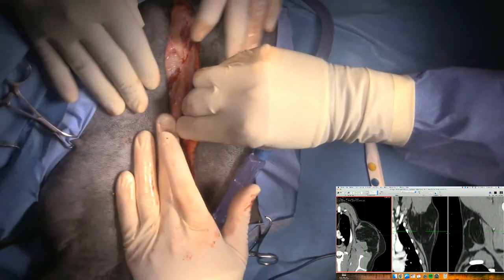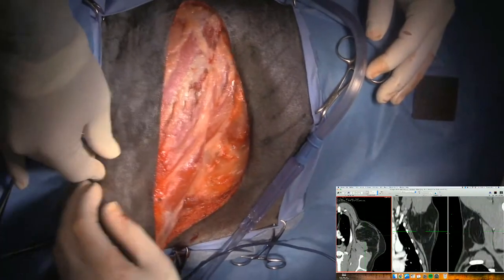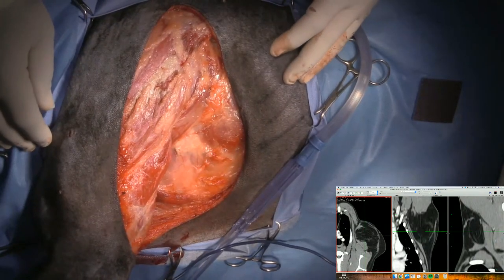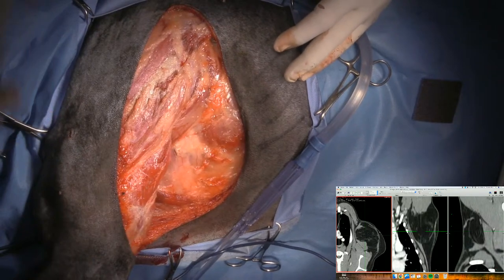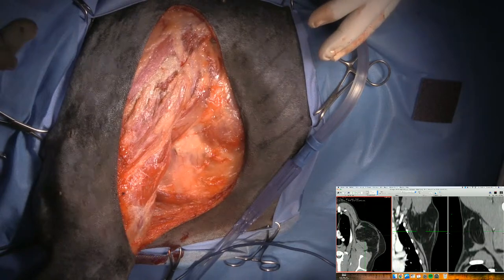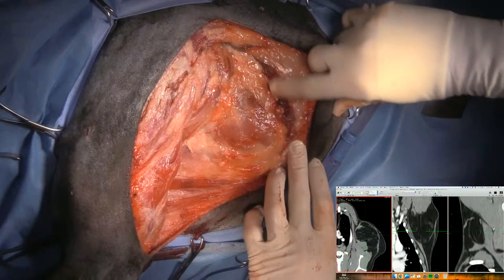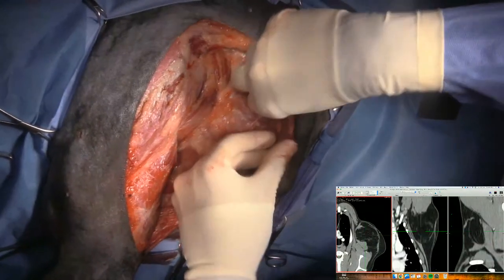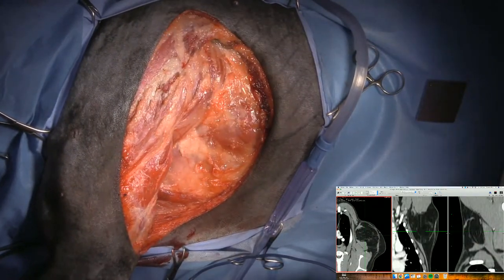Is this going to close? I think it'll be fine. I'll pull the leg back a little bit with my deep closure. So that's the cut surface, cut edge of the latissimus dorsi right there. And again, I don't think I'm going to do much. I might try to reattach it to the back of the scapula. That would probably work.